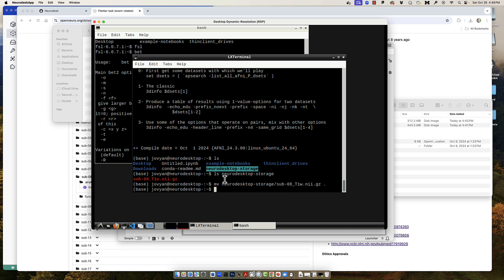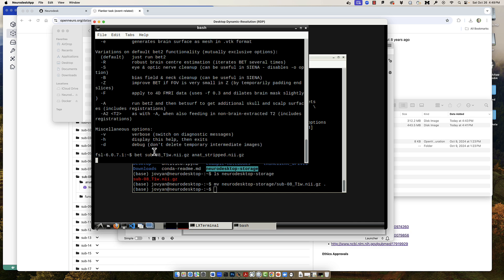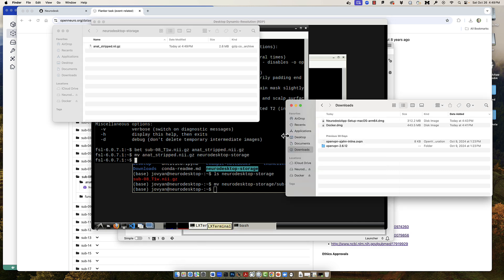In this case I'll use my terminal with FSL to perform a simple skull stripping using FSL's BET tool, which only requires an input and an output file name. Once it finishes, I can then move the finished product into neuro-desktop-storage and from my local machine drag and drop that file onto my desktop.